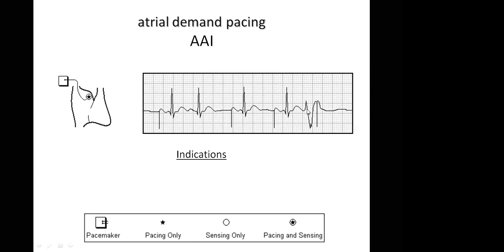Are we getting it, Doctor? Yes, sir. So that's what is happening here. The pacemaker is not bothered that a VPC is occurring and it's pacing on the VPC. No, it's not sensing the ventricle. Its duty is to pace the atrium. So if it does not sense atrial activity, it will pace. But the last paced beat was not transmitted to the ventricle because the ventricle was in its refractory period. Refractory period, thank you. That's what happened there.